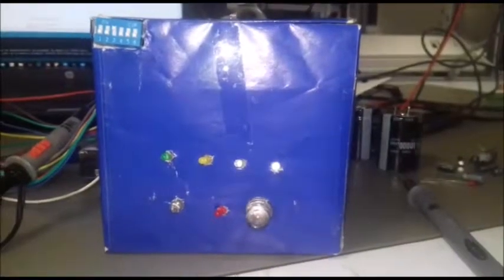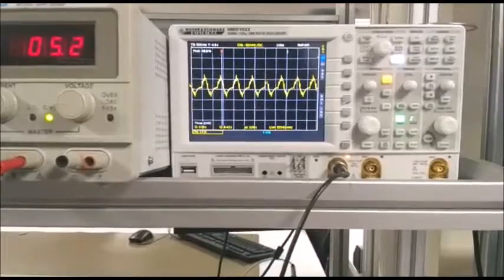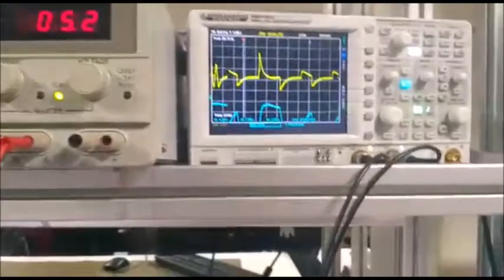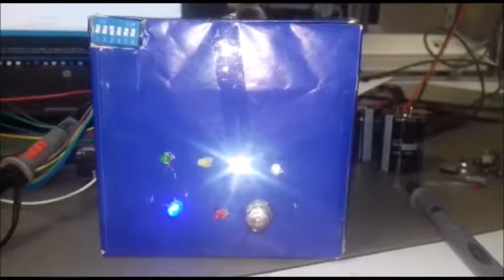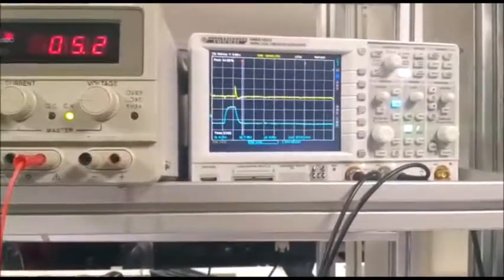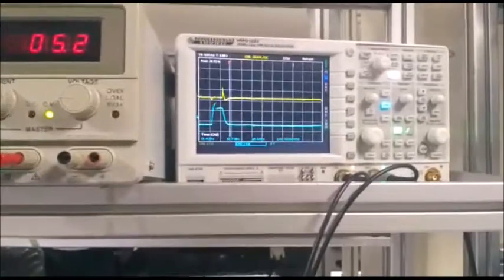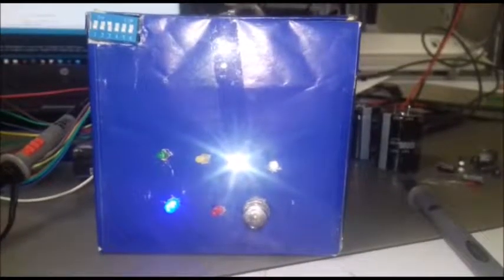In the third position, we have the tachycardia with the white LED. In this case, we also use the equipment with the same methodology of 3 discharges that increase their energy proportionally after checking the patient's signs reading.